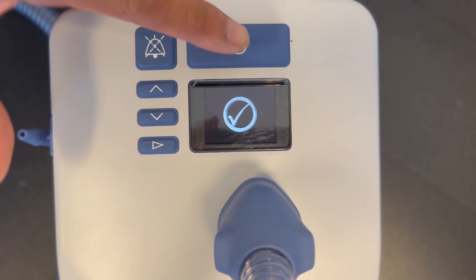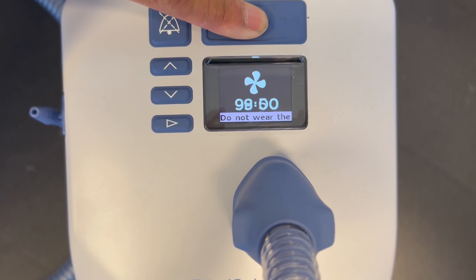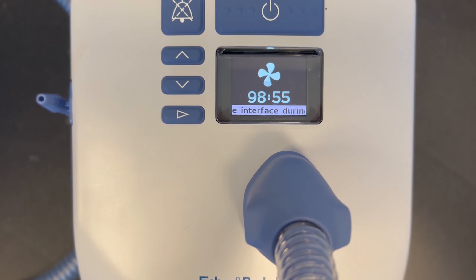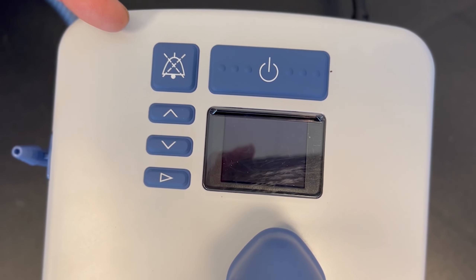To turn off the device, you press and hold the power button for five seconds and the number indicated on the screen is the drying cycle. You do not want to wear your mask during that period. This button here mutes all system alarms.